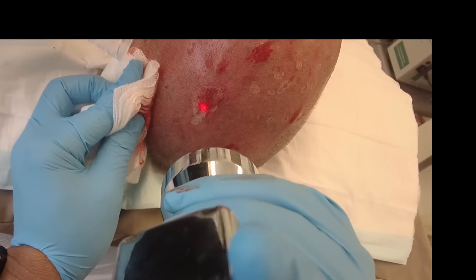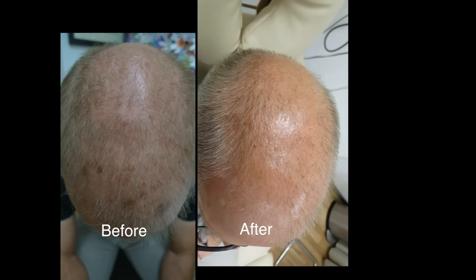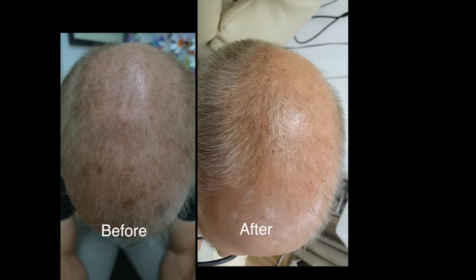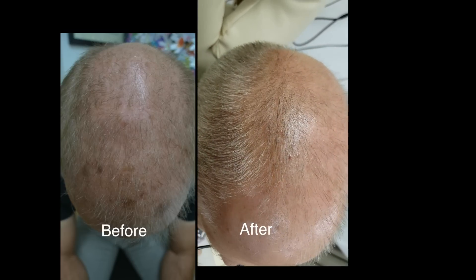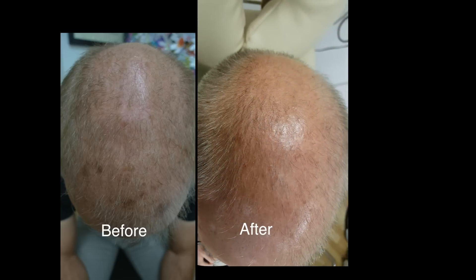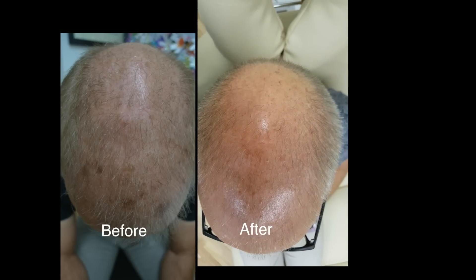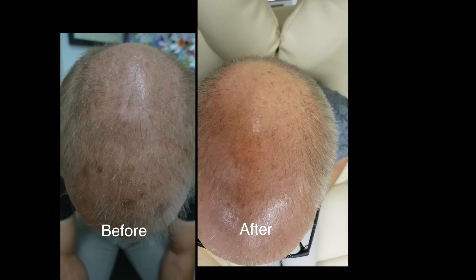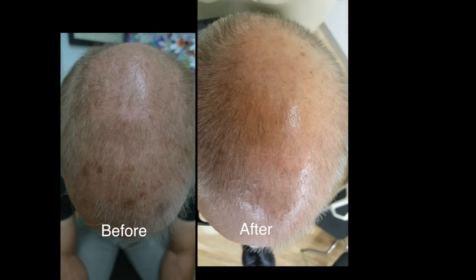We're giving a good clean-up here and going to the base of these seborrheic keratoses. Shortly you'll see the before and afters — on your left the before and on the right the results after three weeks. It's a marked improvement of the seborrheic keratosis. With this procedure using the curette and laser, you do not lose any hair at all because we're working very superficially and the hair follicles are deep in the skin. So this debulking actually helps.